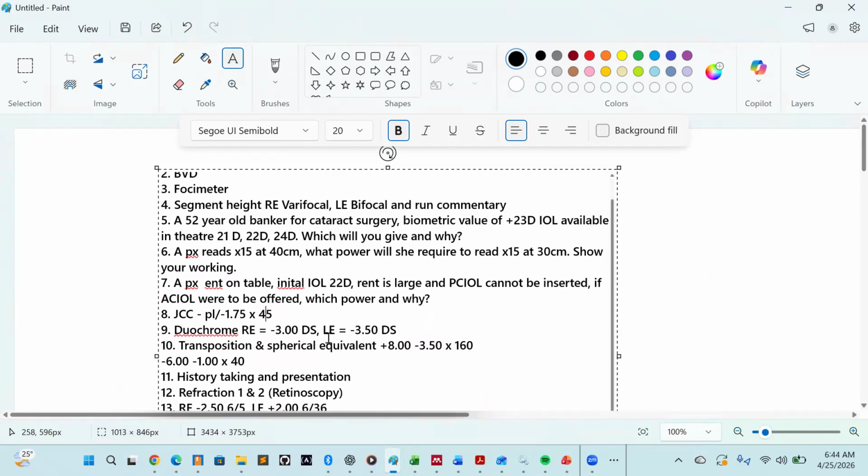If the patient said it is equal, be it minus 3, you always bring the less, like minus 2.75, because you don't want to overcorrect them. So you always go lower. I'm sure this patient is probably equal at minus 3.25. That's why the answer was minus 3. Especially for the first time, you can watch the video on that and you see it.